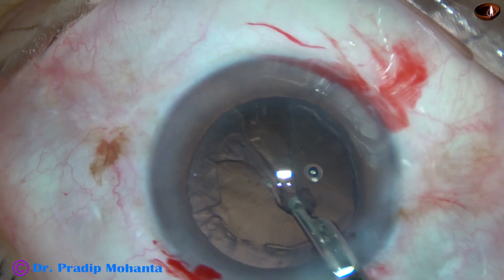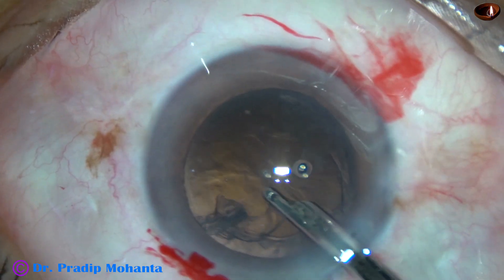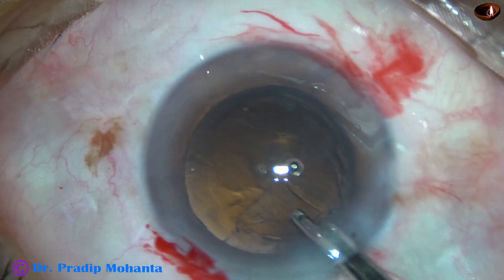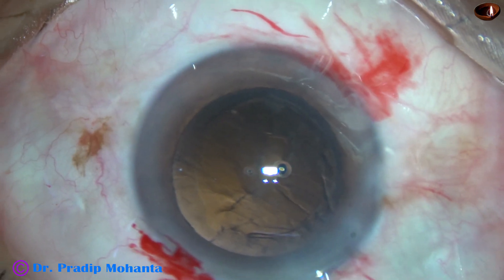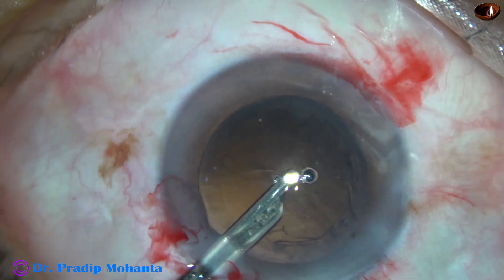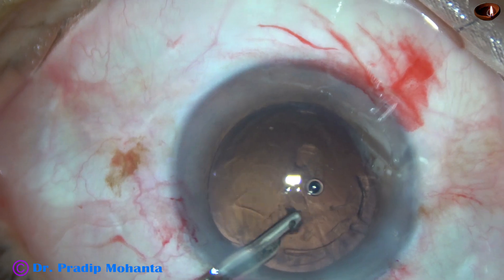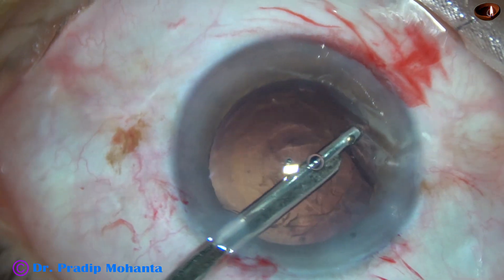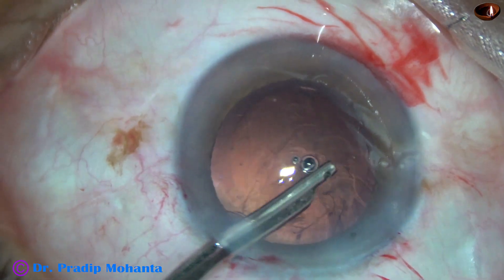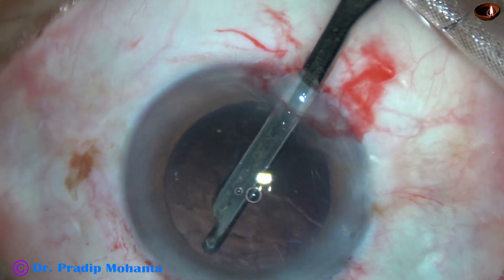This rent has happened in my hands probably after about 6 months or so. Now this is dry aspiration. I am using a Simcoe cannula without irrigation — this is a 23-gauge Simcoe — using it without irrigation and aspirating all the cortex. Because if I use irrigation, it is going to hydrate the vitreous and vitreous is going to come into the anterior chamber. But if we don't use irrigation, vitreous prolapse will not occur.